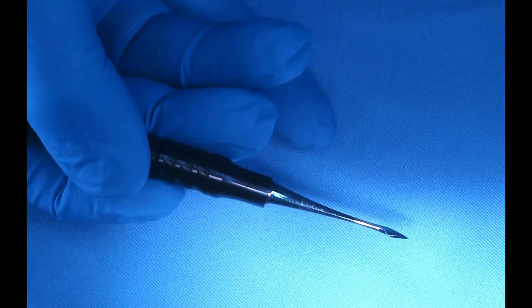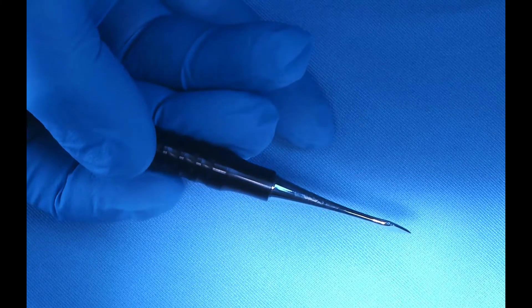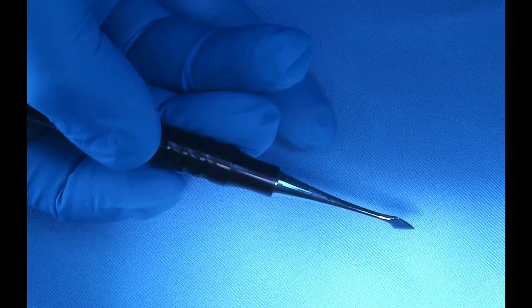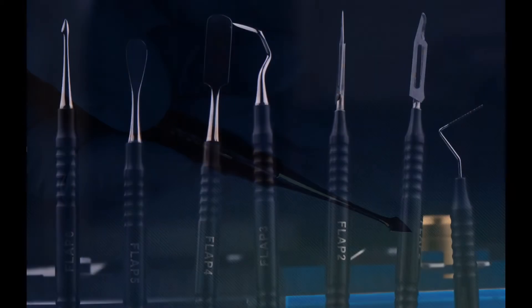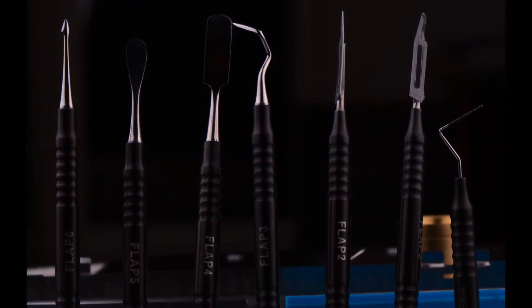The straight part, which looks like an arrow with a pinpoint, allows me to start the reflection of a small structure. Here are the six instruments for flap reflection — our flap instruments: the periodontal probe, our blade holder (we actually have two in our kit), the Orban knife, the periosteal elevator, the Molt 9, and the Boozer instrument.